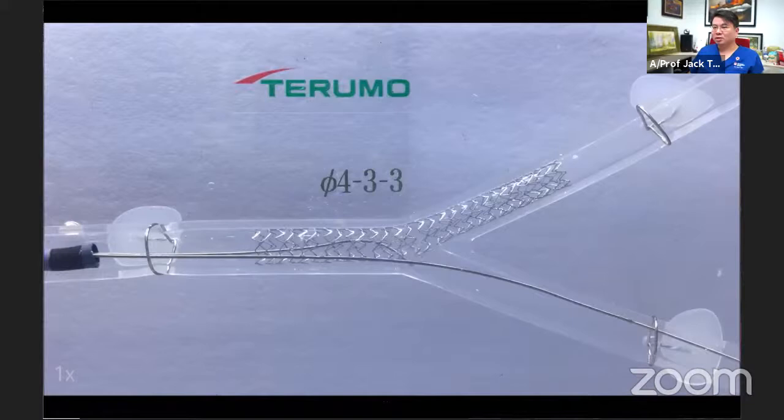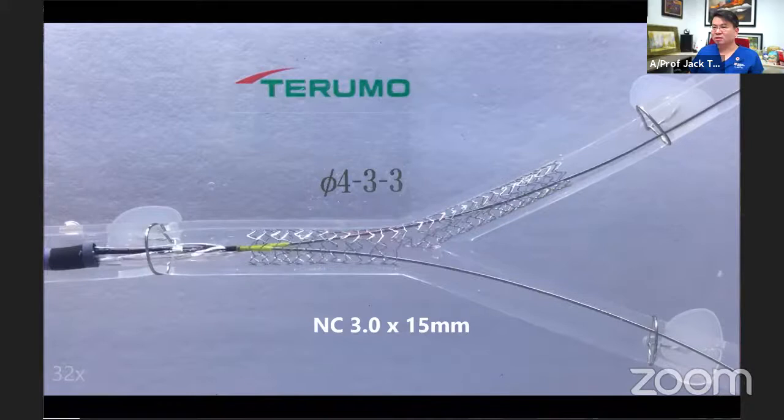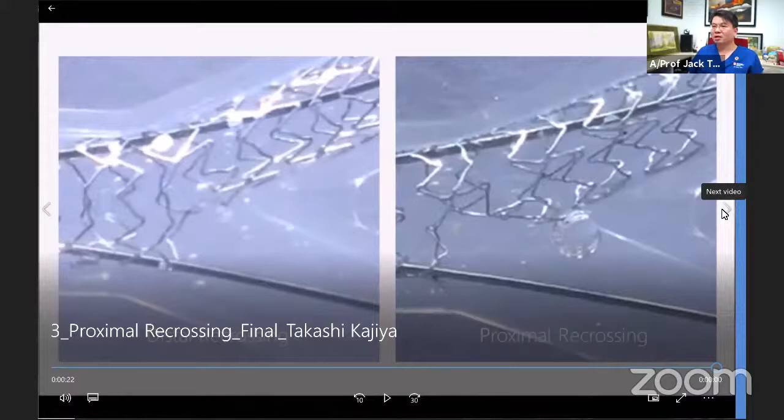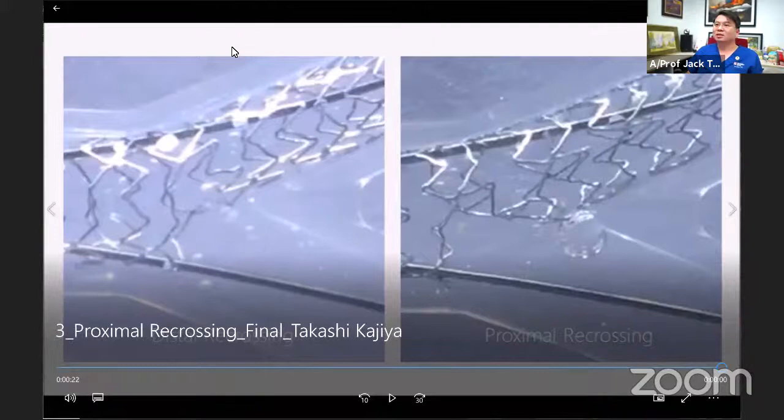Actually, Rosli and Sydney also talk about proximal versus distal wiring. So this is a demonstration of what happens in proximal wiring. Can you really appreciate this on angiogram, actually, if it's not on the bench? And does it really contribute to an adverse outcome? What do you guys think, Rosli and Sydney?